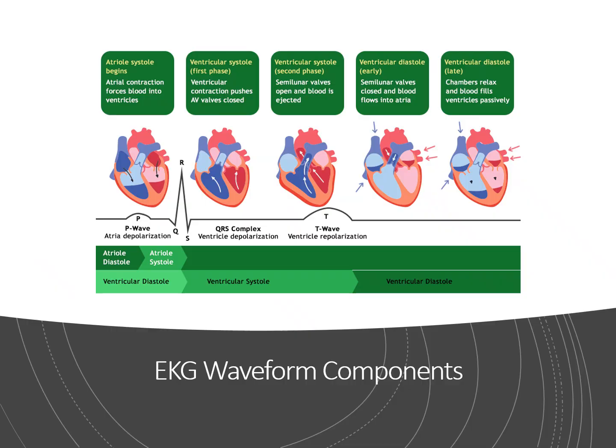Now let's break down the EKG waveform. As we get into this section of the presentation, I don't want you to get discouraged. Even as a seasoned nurse working in the emergency department, this part requires constant review because the heart, even though it is a muscle, is a big electrical circuit.